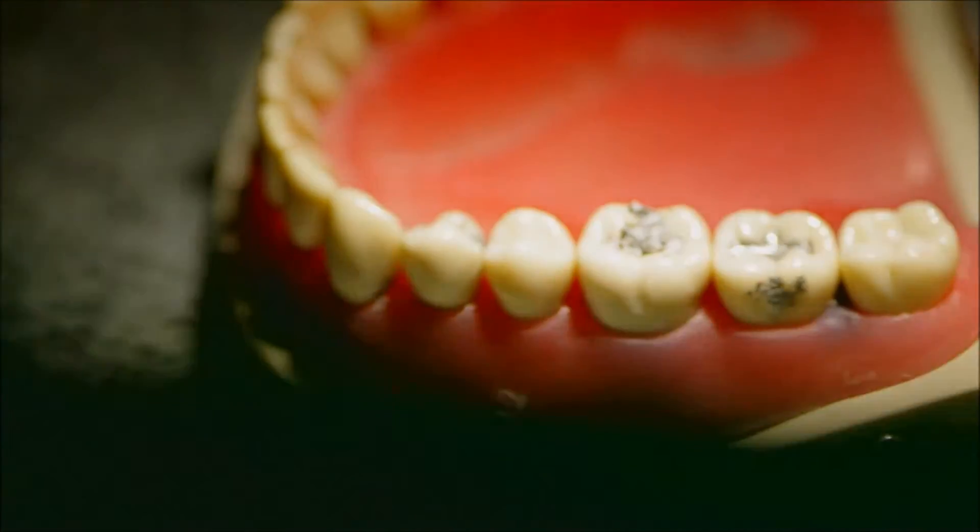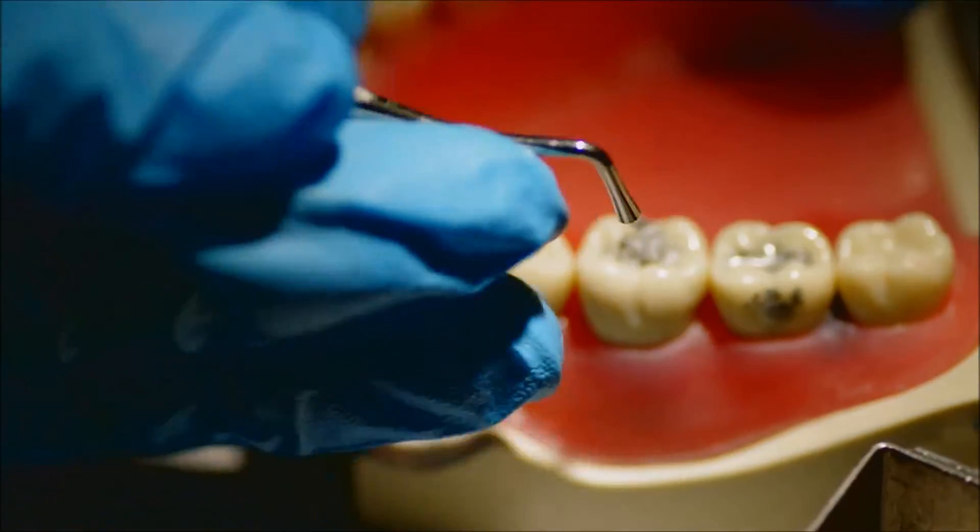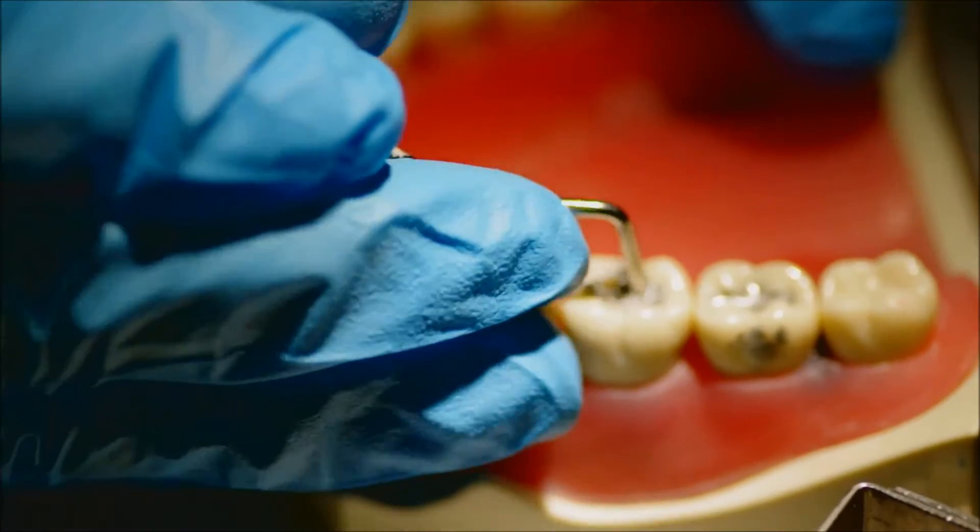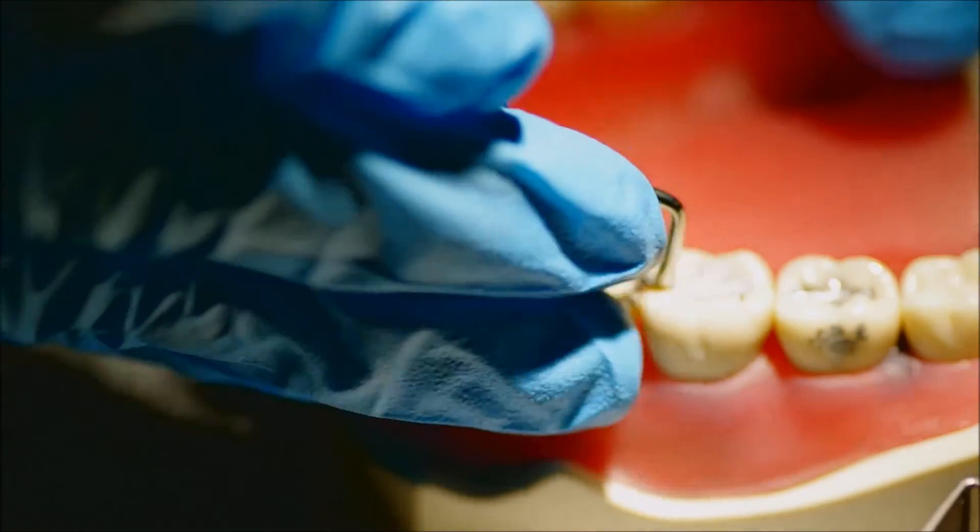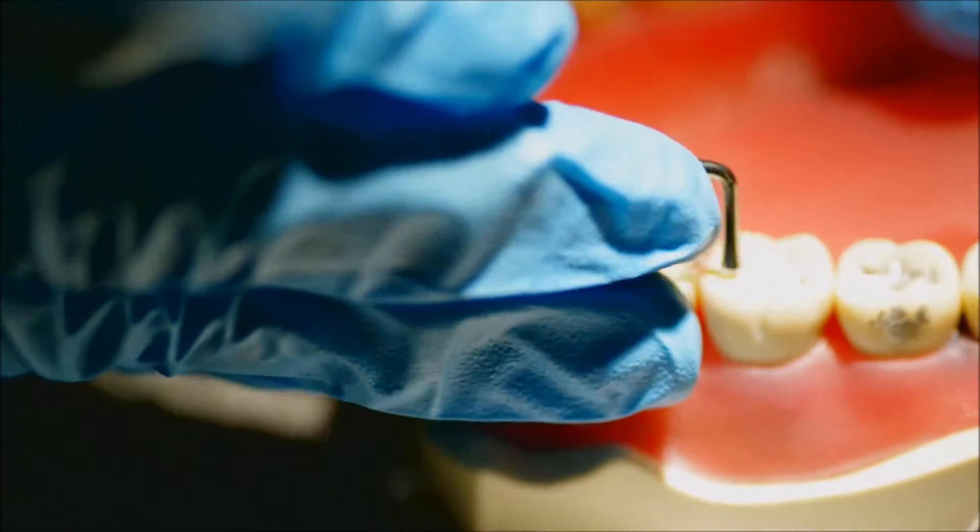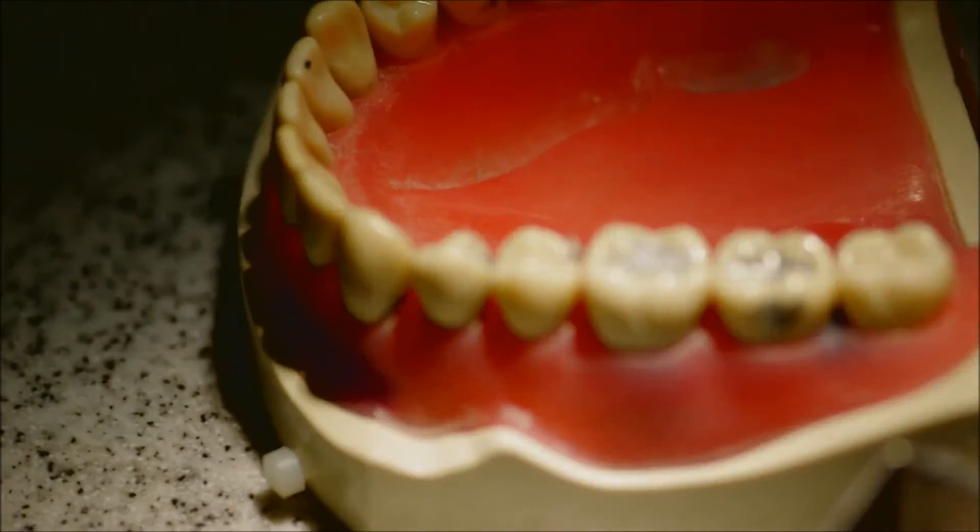This, in a clinical sense, will allow your restoration to last longer, but in a preclinical sense, it will give you a much nicer restoration with less flash to contour and carve.